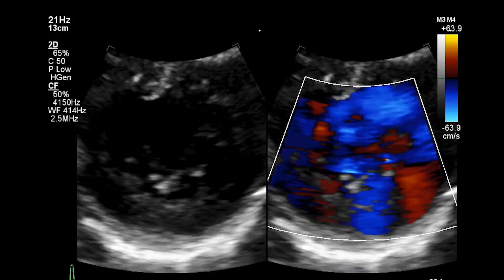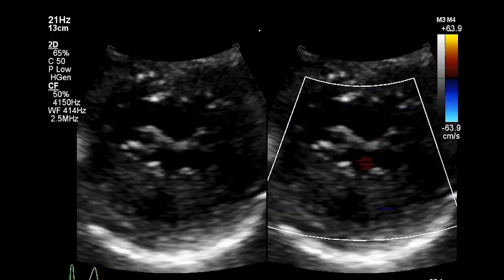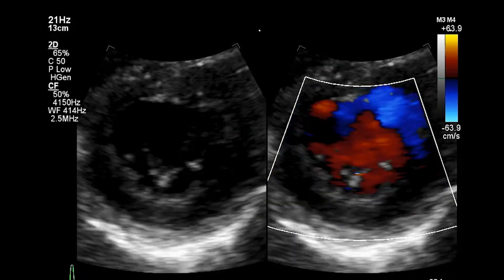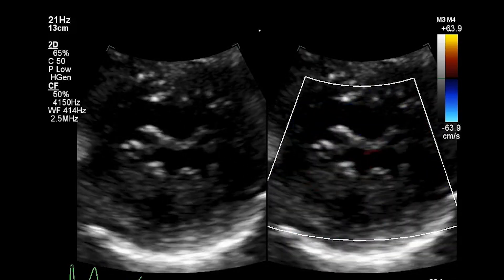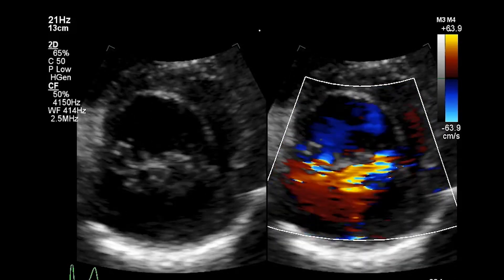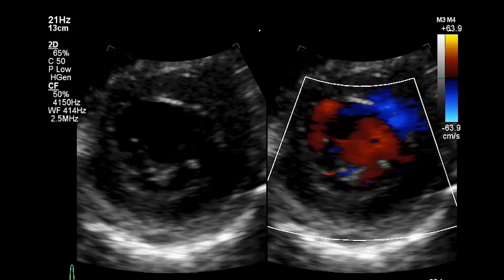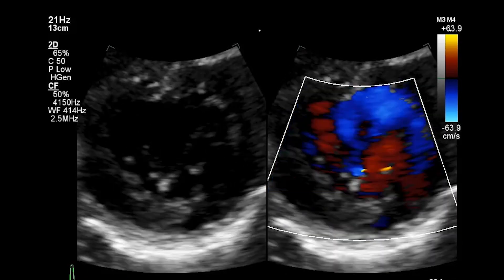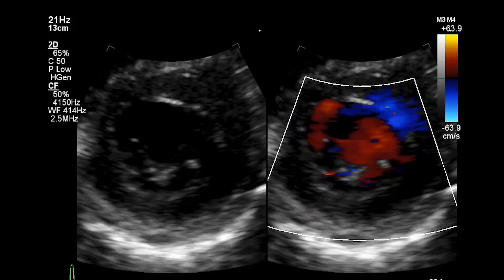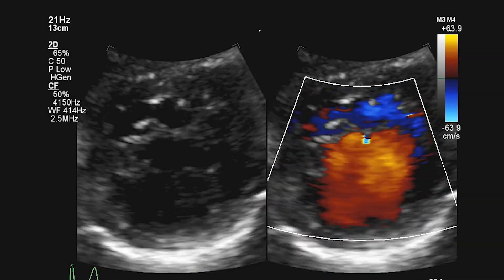In this particular example, regurgitation is severe, but you can have patients where there is just a small jet arising along one commissure or one scallop, and you may wish to report from which segment this is arising.